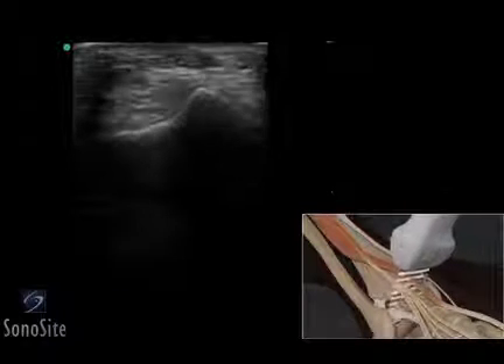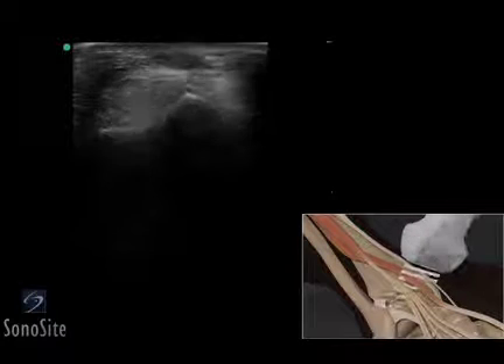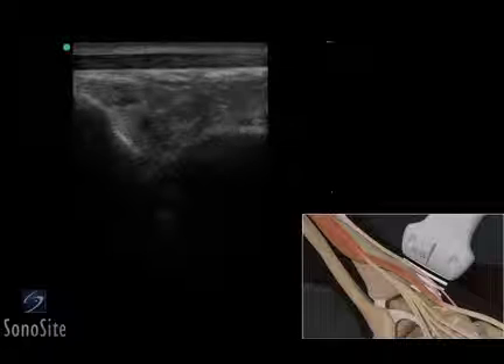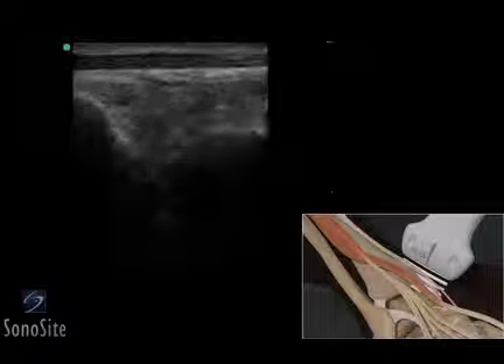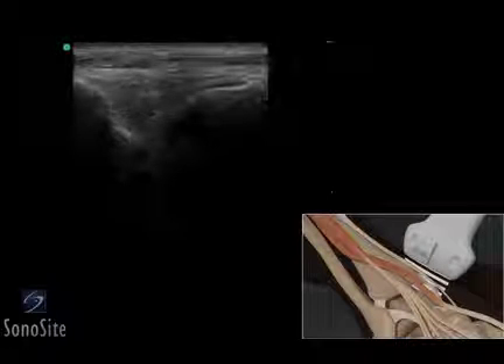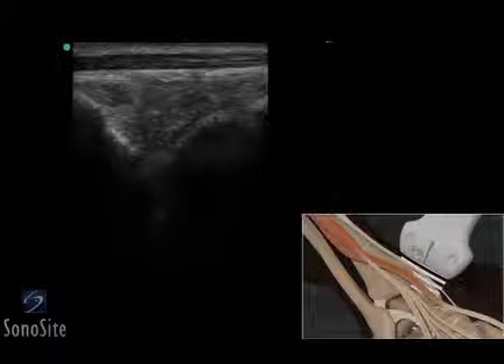The transducer is centered on the anterior tibial tendon and rotated 90 degrees clockwise. The fibrillar pattern of the tendon is identified anterior to the ankle joint. The tendon should be scanned medially and laterally to evaluate for tear or tendinopathy.